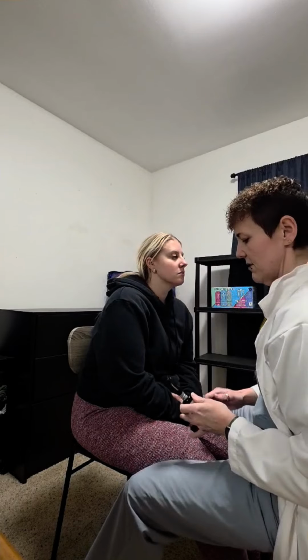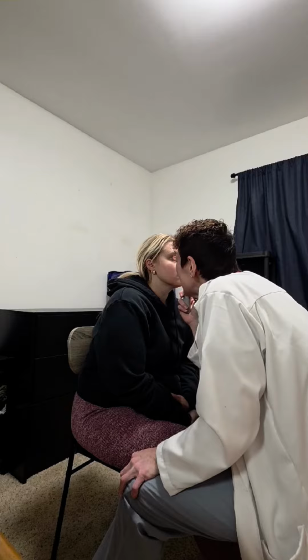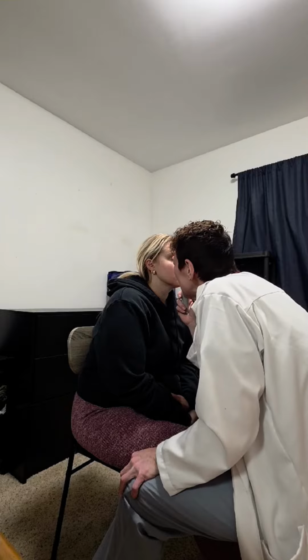All right, we're going to start with your left eye. All right, the red reflex is present. The optic disc is seen. It is orange in color. Retina is intact, no opacities, and the vessels can be seen in the left eye. I'm going to go ahead and do the same with the right eye. Red light reflex is present. The optic disc is visualized. It is orange in color. Retina is also visualized intact, and the vessels are also seen in the right eye.